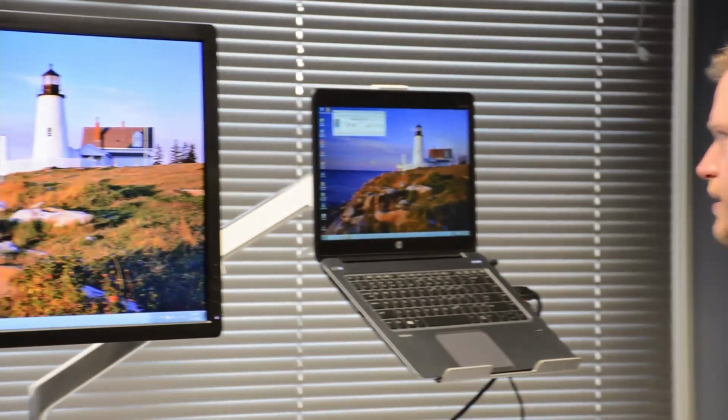January is Glaucoma Awareness Month, so we thought today we would demonstrate some of the technology available for individuals that have glaucoma or even other low vision disabilities. We're going to start off with some software on the computer, then I'll move on and show some of the hardware that is available and some of the portable devices that a lot of USDA employees are starting to get for the position. So first, we'll take a look at some of the software.